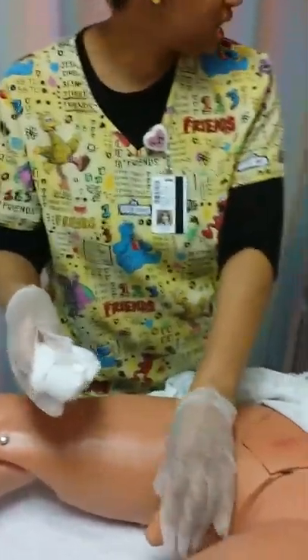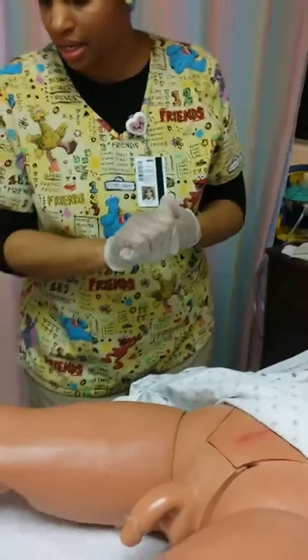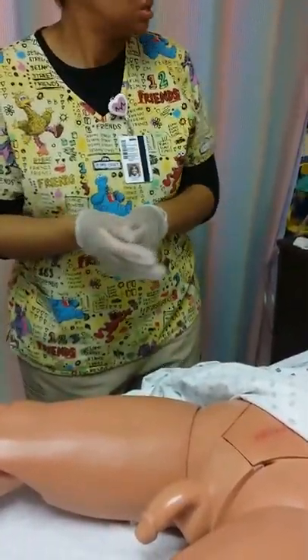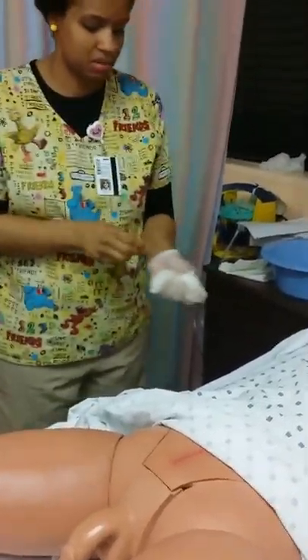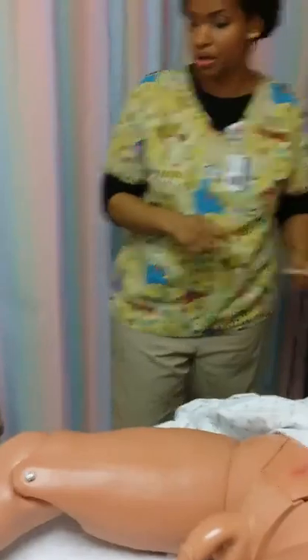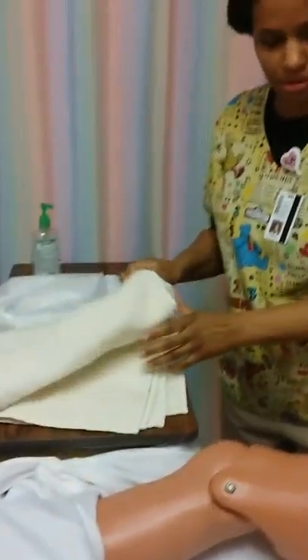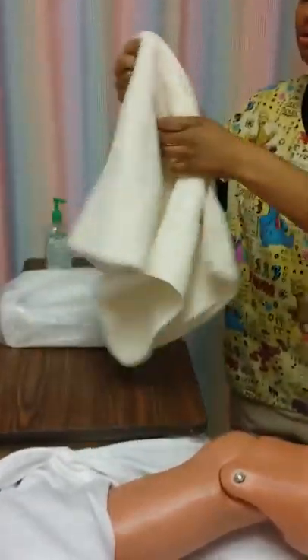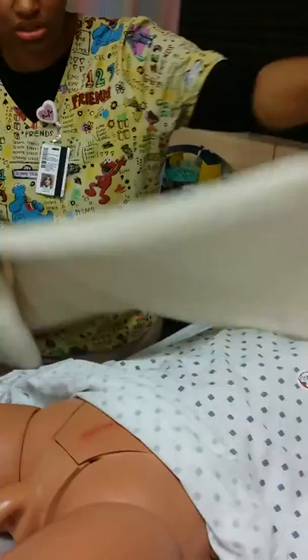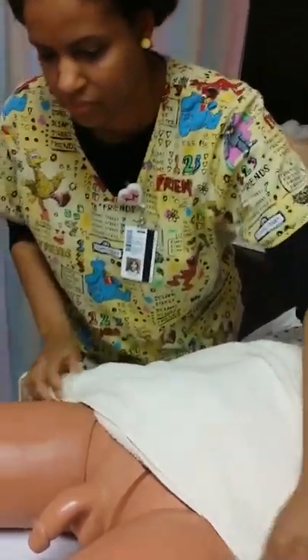I'll go ahead and dispose of this. And I'm going to get started on my sterile field, okay? So I'll get rid of these gloves and dispose of those in the trash. And get my towel out, just pretty much anything you can use to provide the patient with a little privacy, okay?